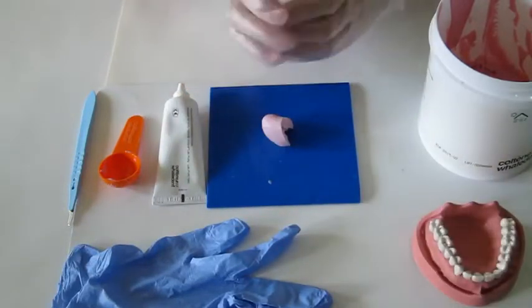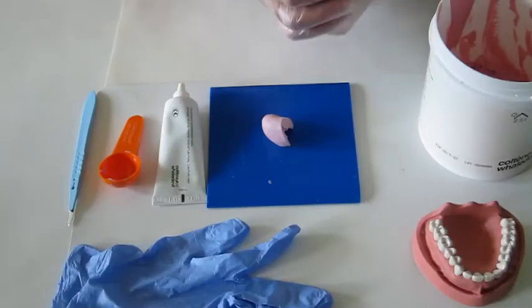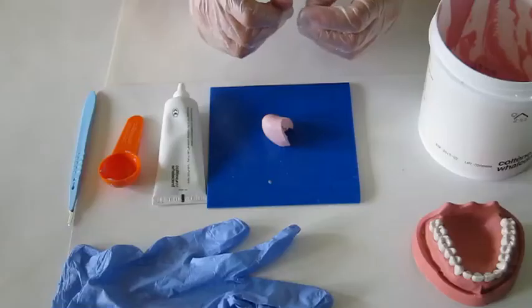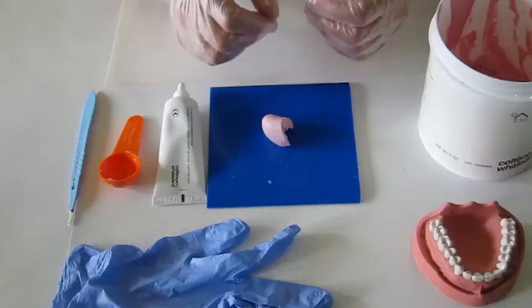You can only use non-latex gloves for this practice, or nitrile gloves when you mix the material, because latex reacts with the putty and affects the setting of the putty.